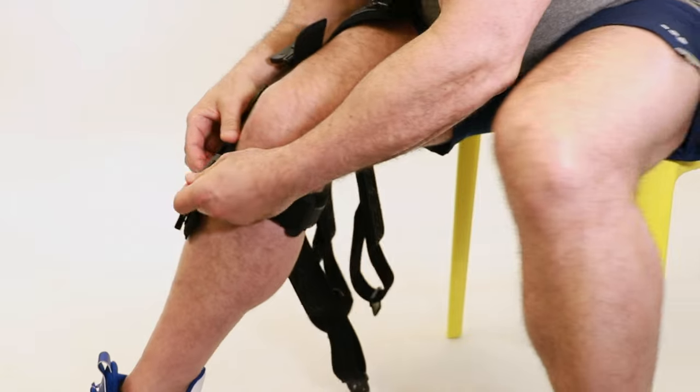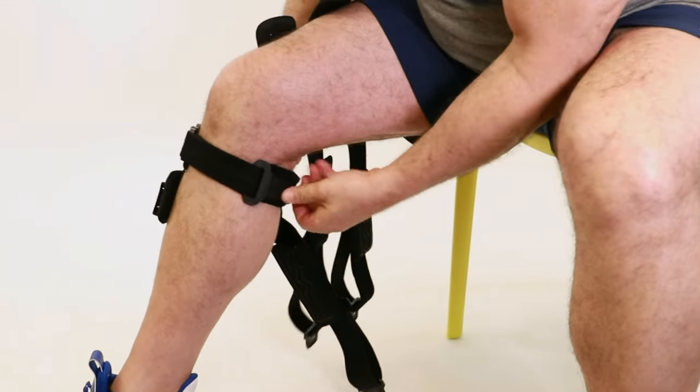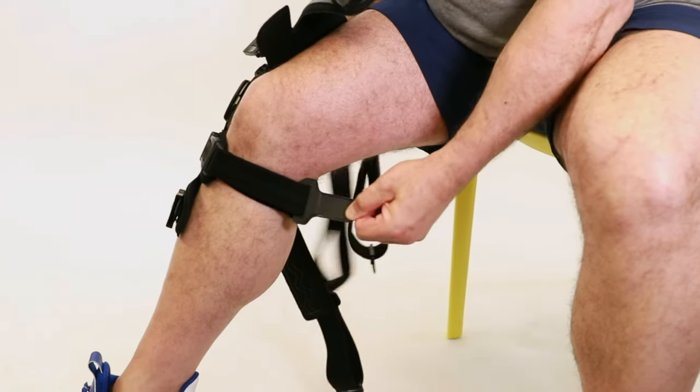Fasten the buckle and then tighten the strap to fit securely, making sure it is angled above the calf to prevent slipping.